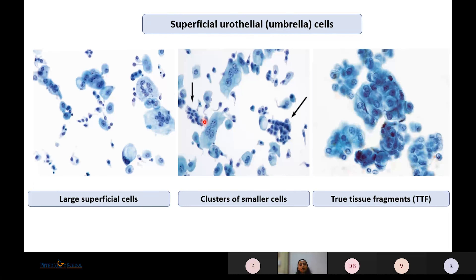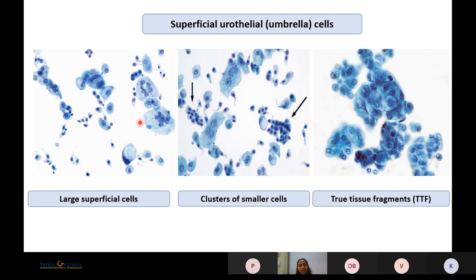Superficial umbrella cells are large, multinucleated, with foamy vacuolated cytoplasm. Their nucleus is round and pale with fine powdery chromatin and conspicuous nucleoli. Multinucleation is a result of instrumentation. Clusters of smaller cells have a lower NC ratio; if appearing to have a higher NC ratio, that is because they have less cytoplasm, but their nuclei are round with pale chromatin and no hyperchromatism — these are benign.